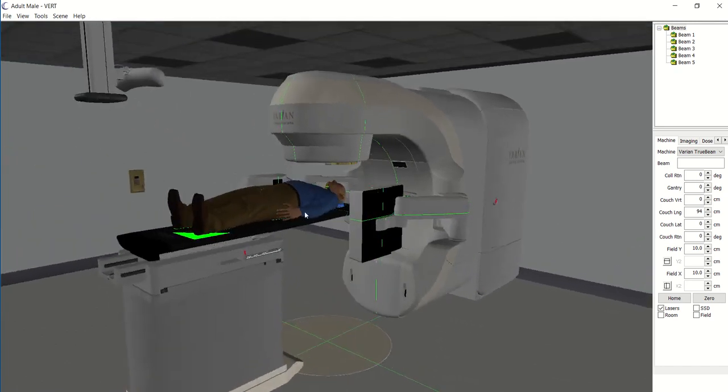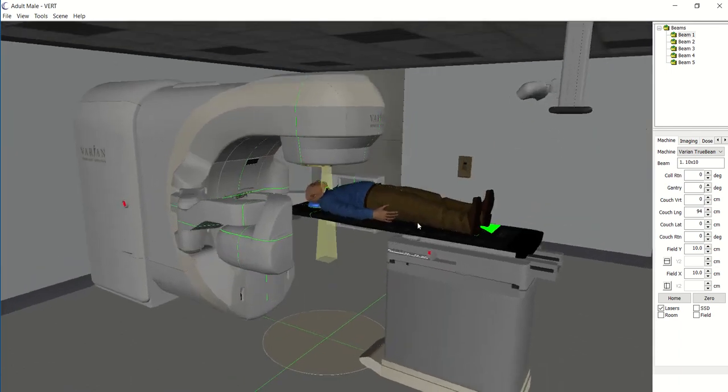Also with the software — something we don't have on the laptop version right now — you can actually see into the patient, so you can see all the different organs that the treatment beam would be going through, because we need to make sure we're not over-treating any of the healthy tissue as well. Well, that's the end of our little tour. I hope you enjoyed it and I hope to see many of you in September.